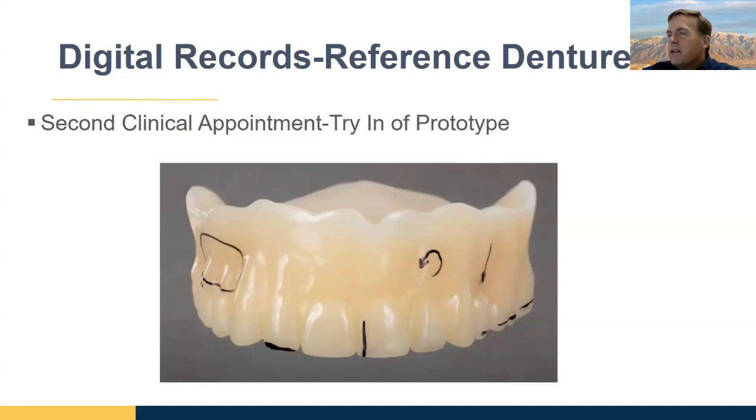But you can set that however you want. We'll usually do 0.8 to a millimeter on a locator case. And again, keep in mind that the denture teeth are bonded to the pink, so it's not like the pink and the teeth are two things. They're one thing when you're all done.